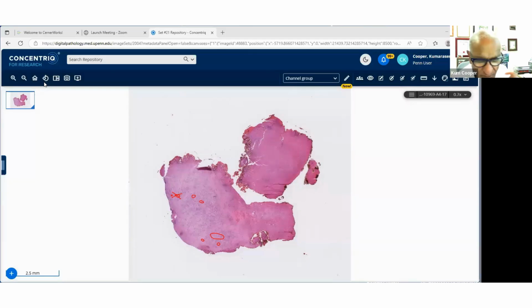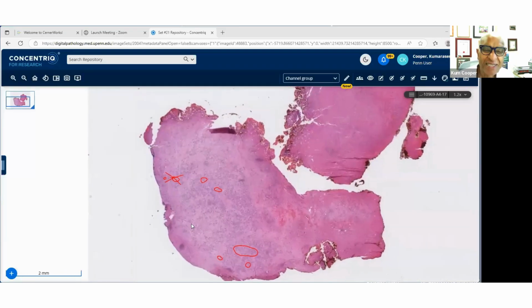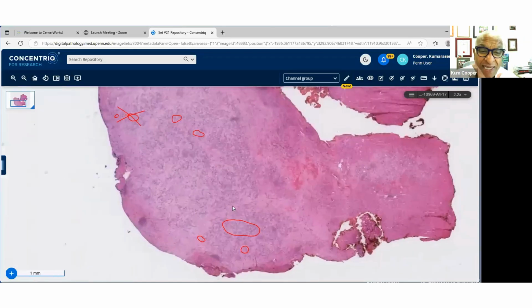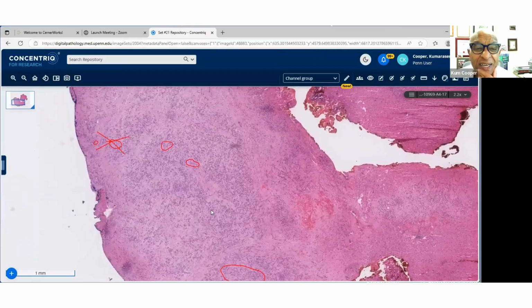So this came from our sister hospital, CHOP, which is the Children's Hospital of Philadelphia. This was a young lad who had multiple lesions in the vertebral body, liver and spleen. And this was a biopsy from his spleen. So I'm just trying to check what his age was. 15. He's 15, a young male.